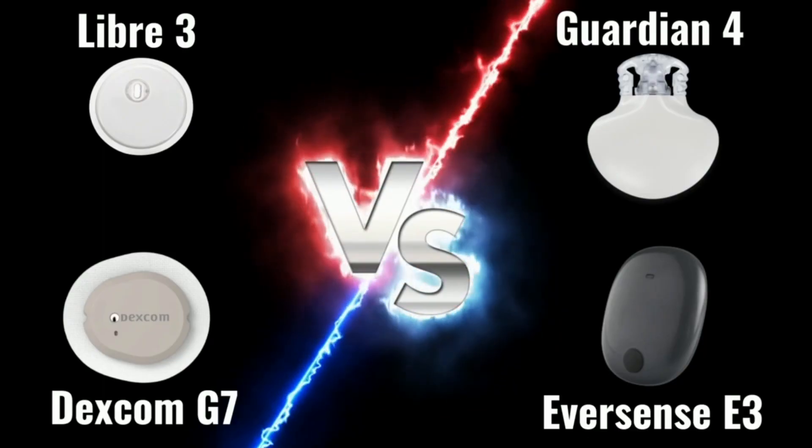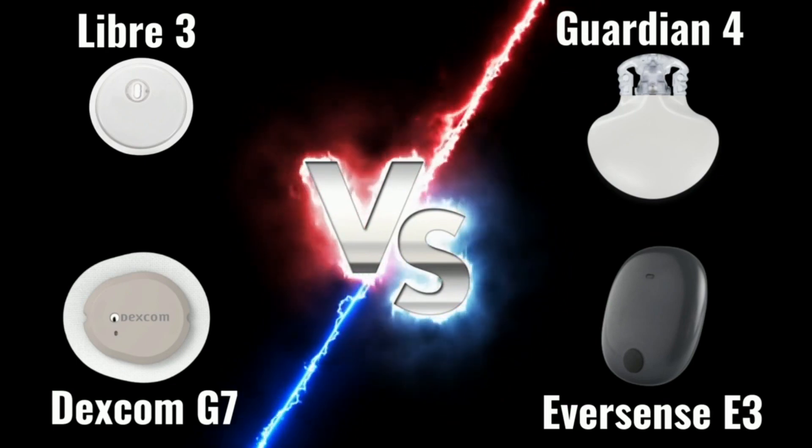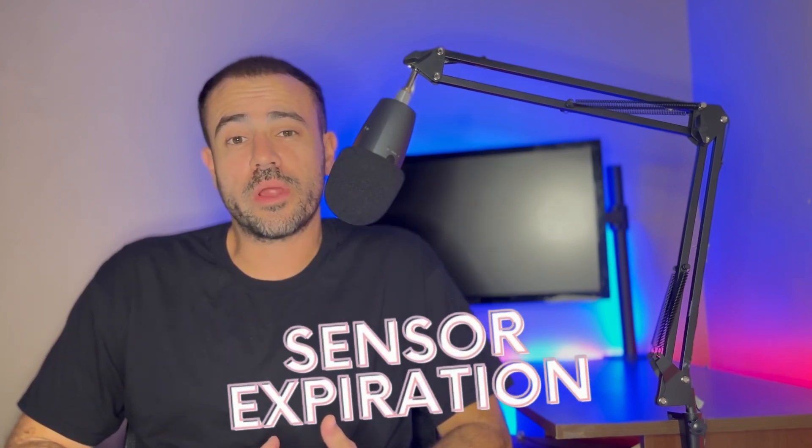This video is a comparison of all of the newest continuous glucose monitors on the market. We're going to go over the big four: Dexcom G7, Freestyle Libre 3, Medtronic Guardian 4, and the Eversense E3. I'm going to cover the five most important key areas — accuracy, size, sensor expiration, warm-up time, and calibration — and hopefully this video will help you decide which CGM to get. Make sure you stay tuned to the end for a breakdown of all the key features of each device.